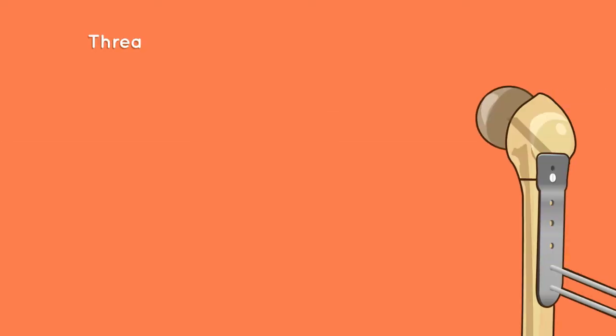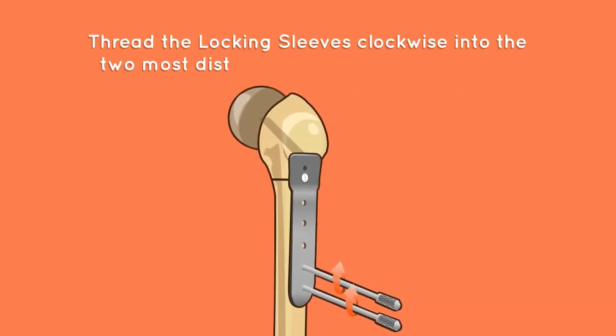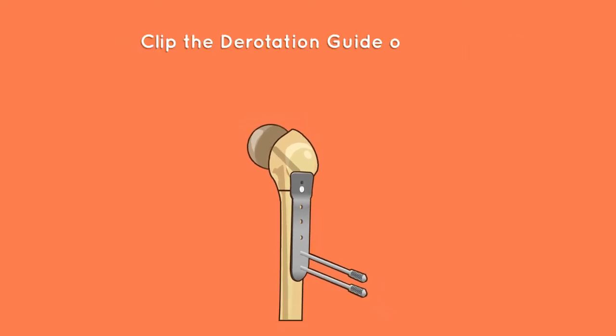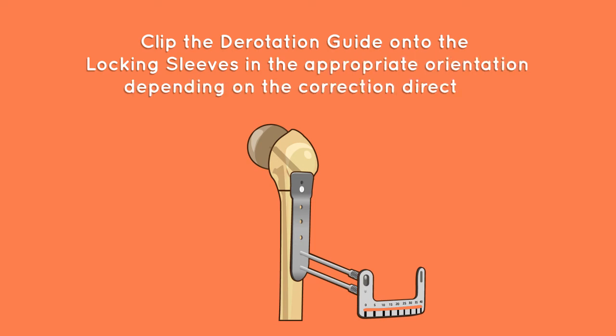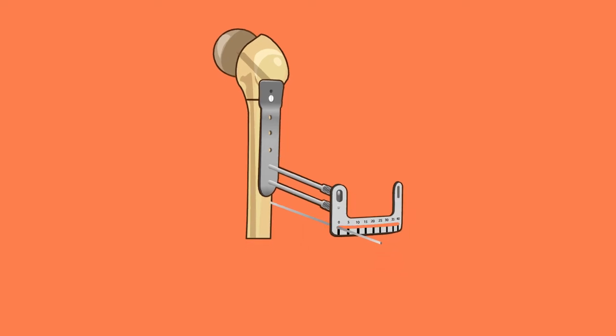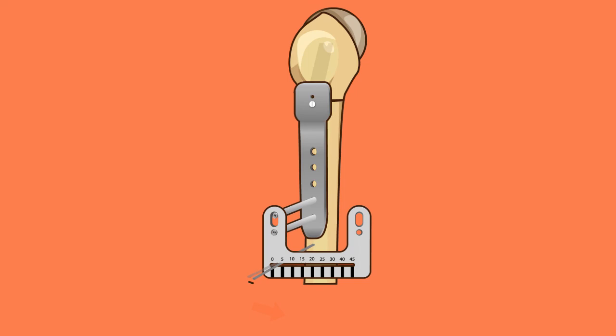Step 11: derotation, optional. Thread the locking sleeves clockwise into the two most distal adjacent holes of the plate. Clip the derotation guide onto the locking sleeves in the appropriate orientation depending on the correction direction. Insert the provided 2.8 millimeter derotation pin into the bone at the zero position on the derotation guide. Release the Verbrugge clamp and rotate the distal shaft to the desired correction angle. Reclamp the Verbrugge clamp once desired rotation is achieved.